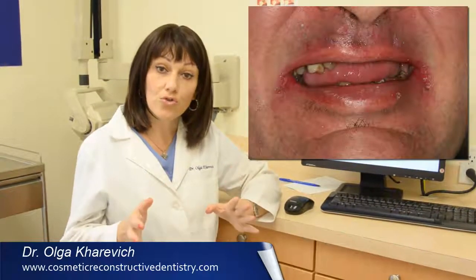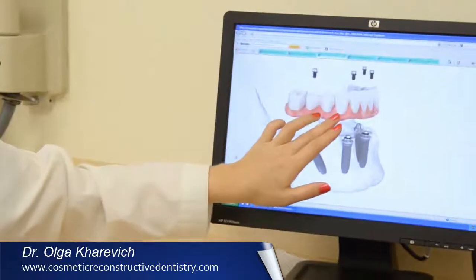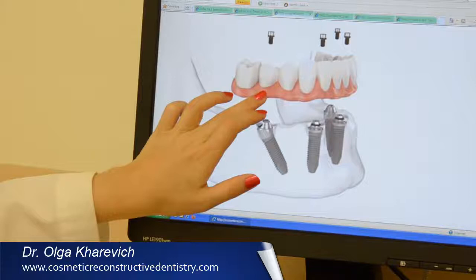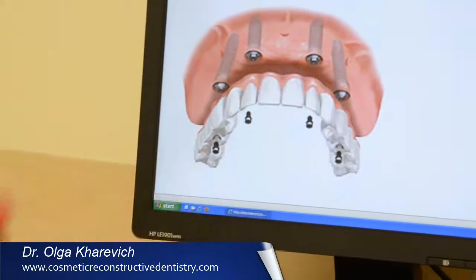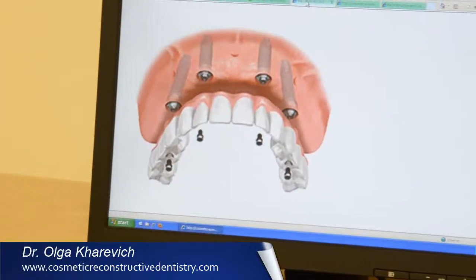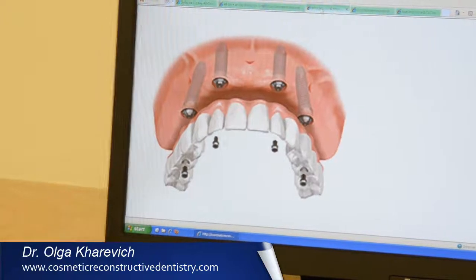During the surgery, when the patient comes, and for example if he was edentulous, we prepare the right new removable prosthesis that later will be fixed, so the patient will have fixed teeth, shown here in this picture. This will be the small denture that will have the pink gum and it will be fixed to the implants. Or it can be another type of treatment, like for the maxilla. In this case, the implants will be supporting the temporary prosthesis, and this prosthesis is not going to have the palate. The palate in this situation will be open.